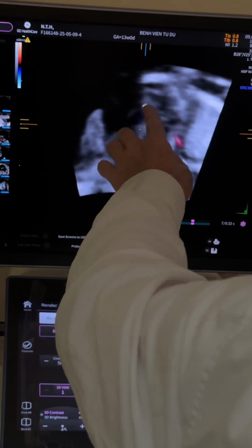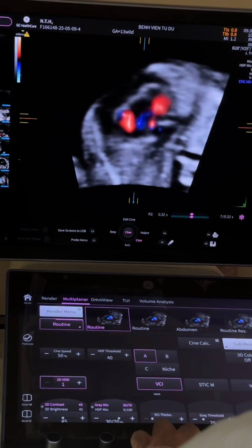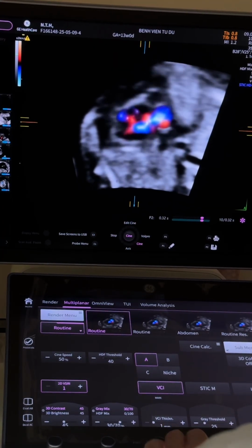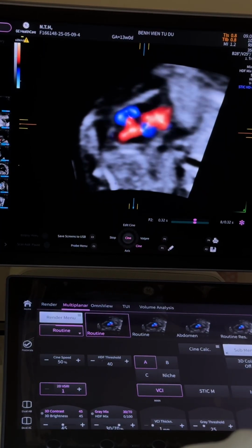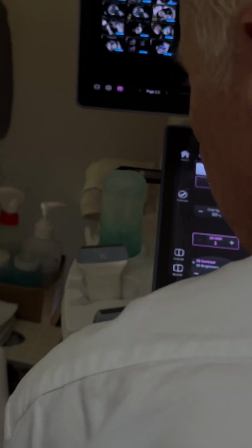That's all the crazy wide course of the aorta coming out of the right ventricle. How could you differentiate between the double outlet right ventricle with TGA in this case? So I don't understand. There's your VSD. So I say again, how do we differentiate between a double outlet right ventricle with TGA?